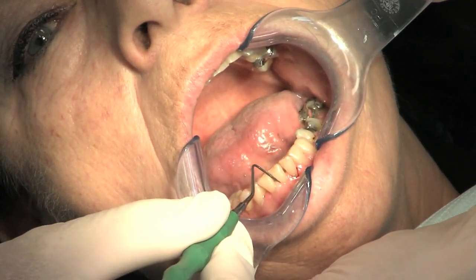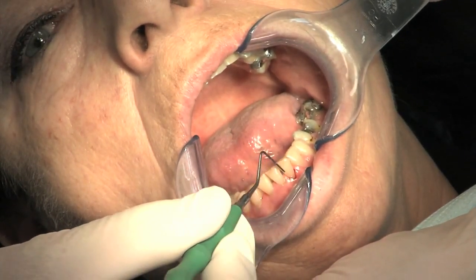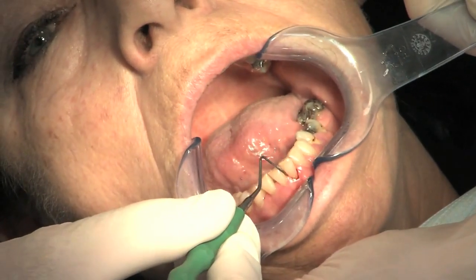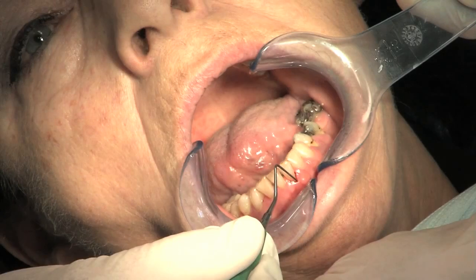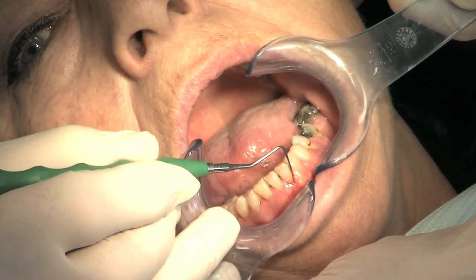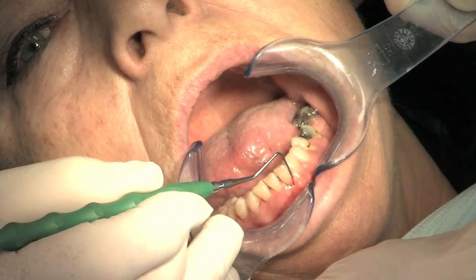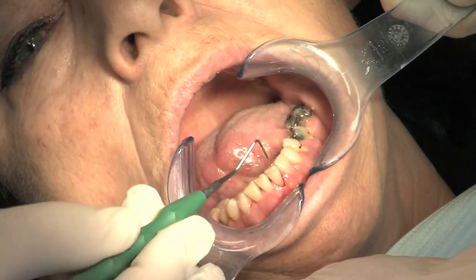When I go here at this position, we have 3 mm, and so on. We have another problem when you look at number 3-1. Mesially it looks good. Here we have a small bleeding because I was probing already before. And then distally here we have again a pocket of about 4-5 mm at this position.